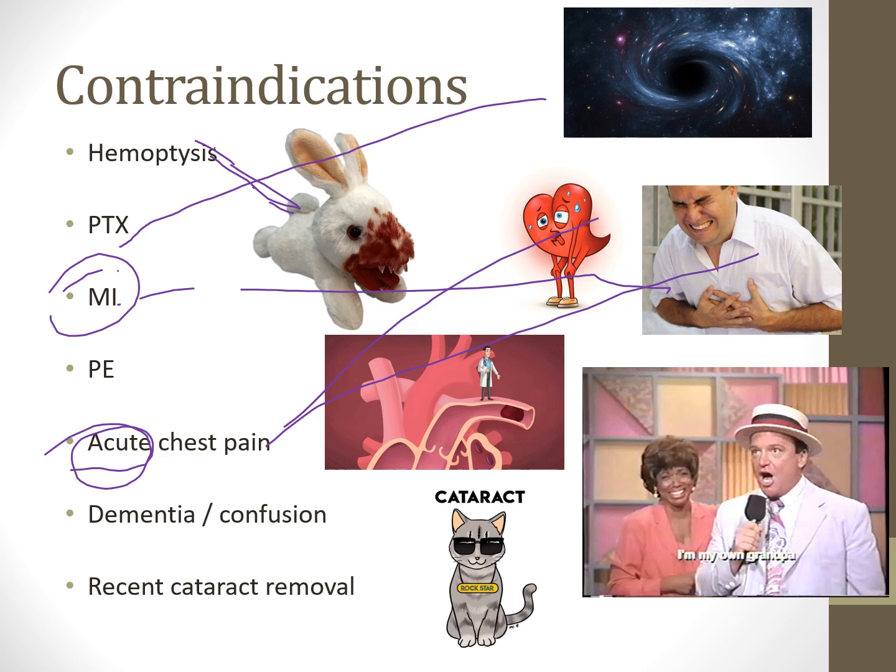Now, did they have a heart attack a year ago? Well, yes, we can do the PFT as long as they're not having a new one. But same thing with the acute chest pain. If it's acute, we don't do it. But if it's something that they've recovered from, or their baseline is that chronic chest pain, then we can still do it.